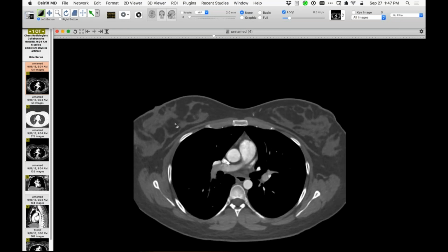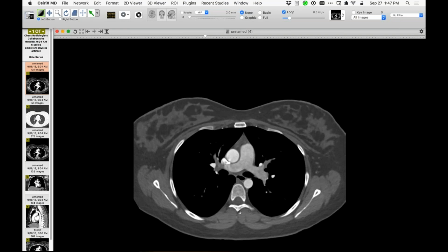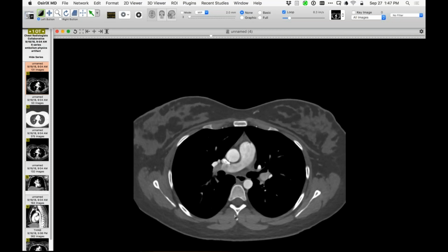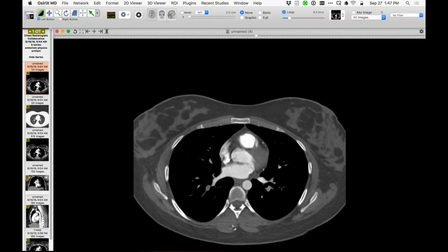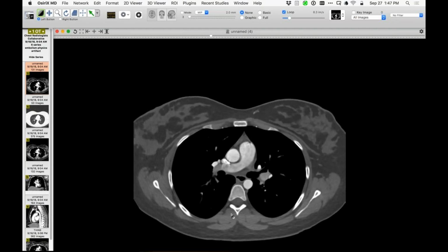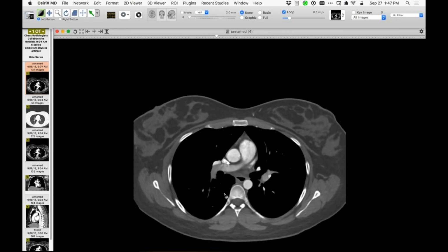And obviously contrast medium has passed through the lungs, but there's an additional bolus coming from the SVC behind it, kind of pushing it along. So here and there, the gray pulmonary arteries represent the bolus of non-opacified blood making its way through the pulmonary arteries and rendering them just plain old gray. And there's contrast medium behind it with a fairly discrete interface between the relatively opacified blood and the non-opacified blood.